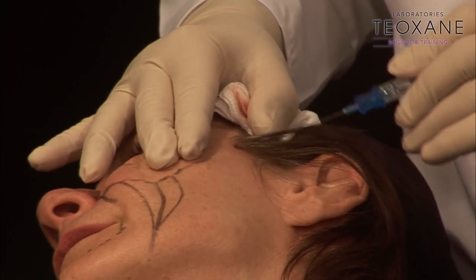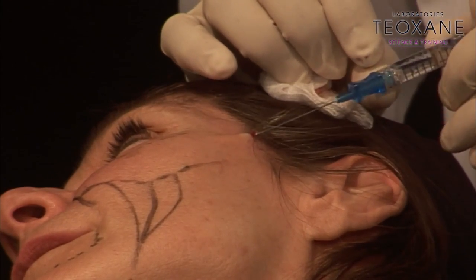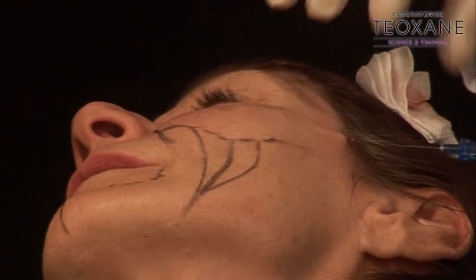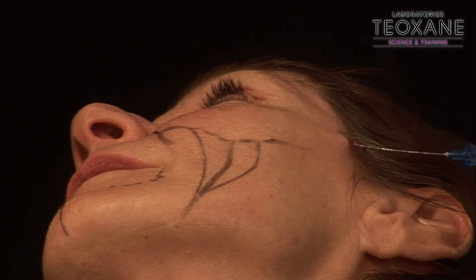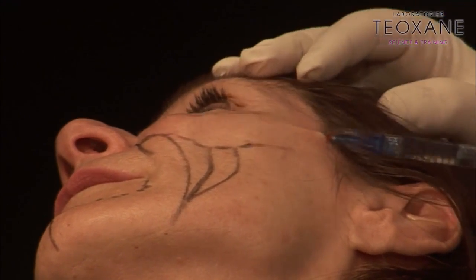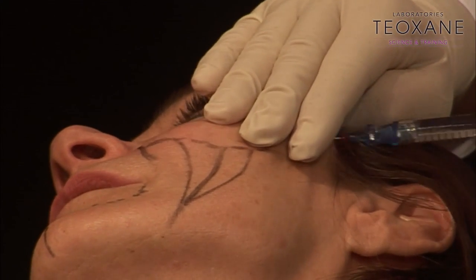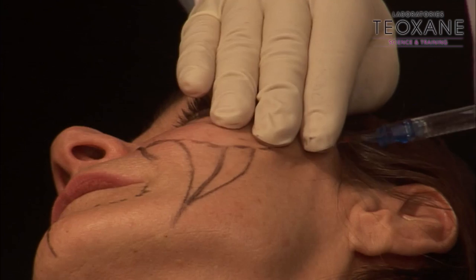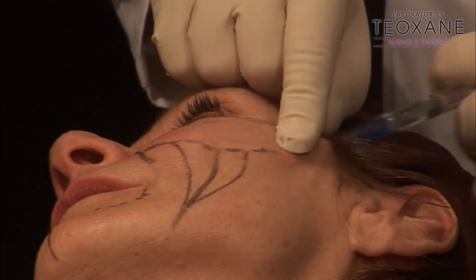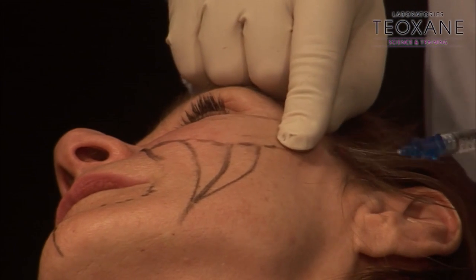So, to show you, the interest with this blue cannula is that I have a mark which shows me where the filler is coming out, here. So keep your chin up. Position is very important, position of the patient and your position. As you can see, I'm quite here. So I'm going to feel the area I've drawn. I try to push my hands for the cameraman to see. See?